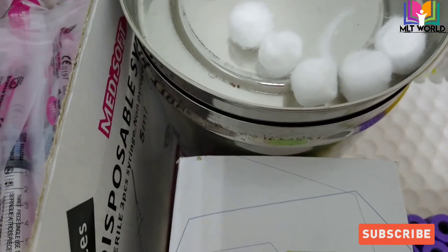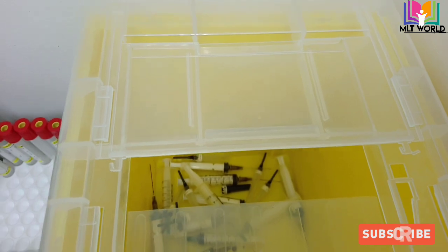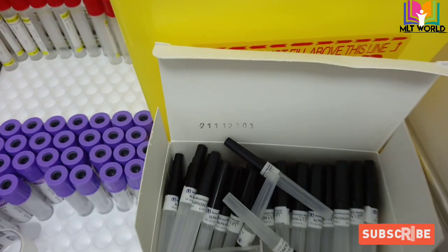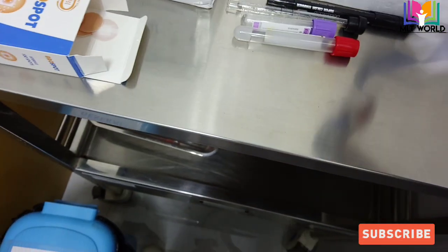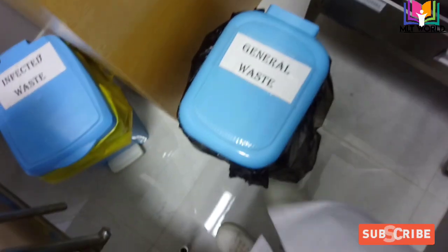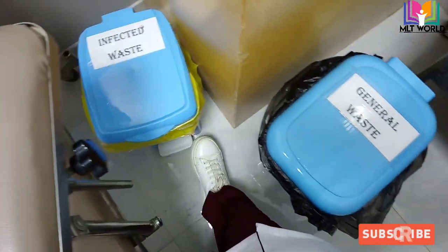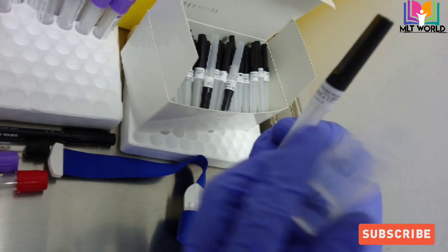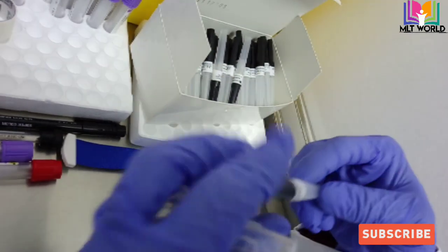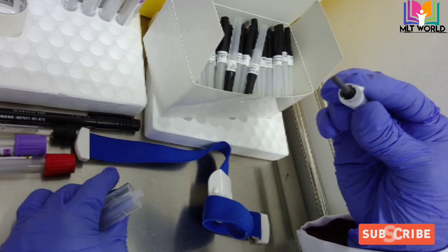Other items we need: spot bandage, alcohol swab — if alcohol swab is not available you can use spirit cotton bud — and a sharp container to discard the vacutainer needles. The holder is multi-purpose and can be reused, but if it becomes dirty you must clean it with sodium hypochlorite diluted in water. Discard the cover of the alcohol swab or spot bandage and cotton in a yellow sharp container.